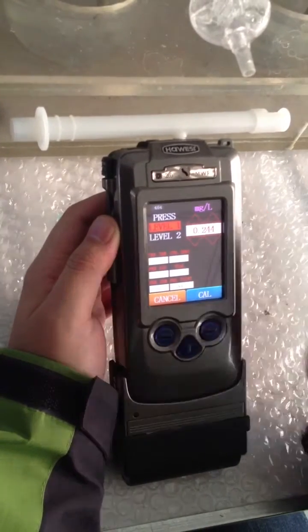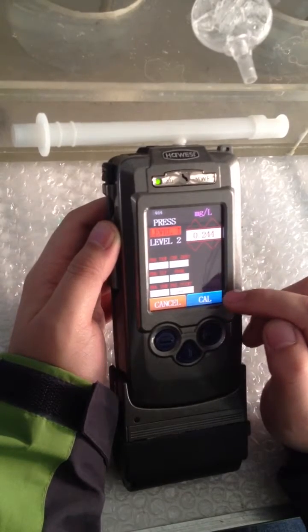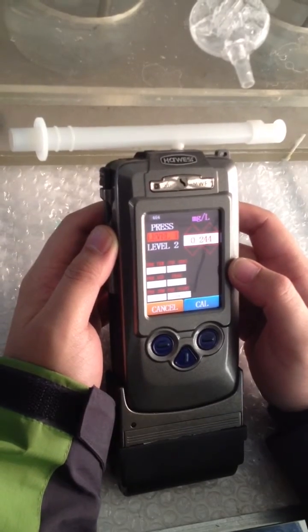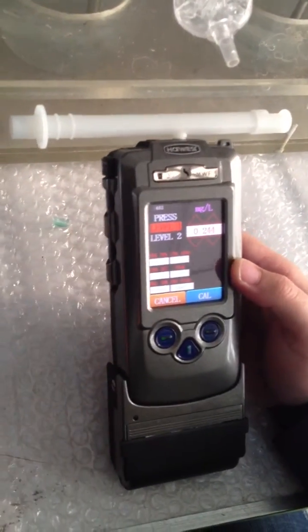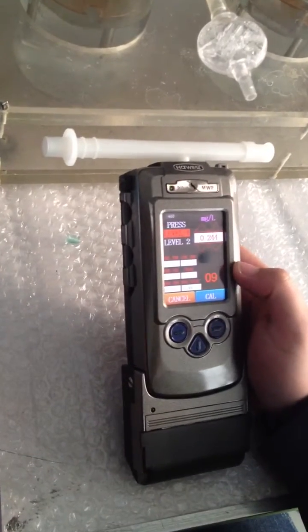I will click the calibration key. After that, there will be a number counting down from 10. When the number comes to 3, you have to connect the mouthpiece with the breathalyzer. Let's do that — pressing calibration here. The countdown starts from 10.